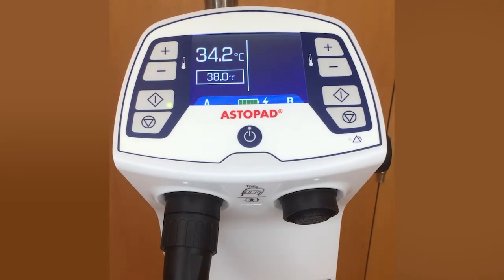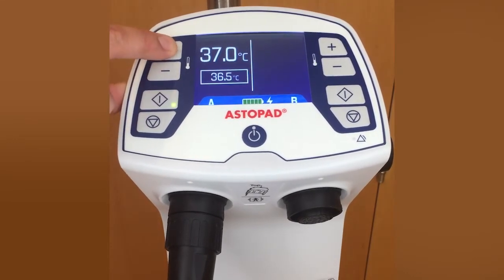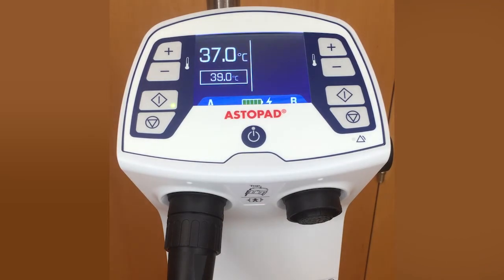The short heating-up time makes the Astopad ready for use quickly. The display shows the actual temperature from the warming blanket and the target temperature within the frame, which can be selected from 32 to 39 degrees. To increase or decrease the target temperature, press the plus or minus button in 0.5 degree steps, then press the start button after choosing a new target temperature to confirm the change.